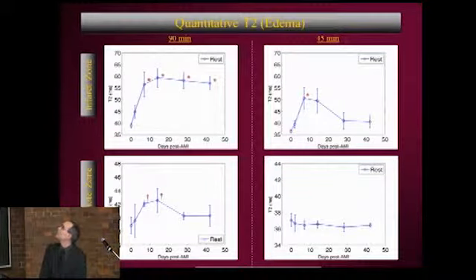The T2 elevates at the 1-week time point, but it resolves fairly quickly and is certainly gone by the 4-week time point. And in the remote territory, you don't really see an edematous response. So again, perhaps more severe infarcts are associated with something going on in the remote territory.